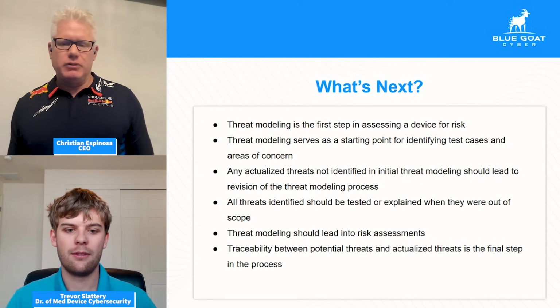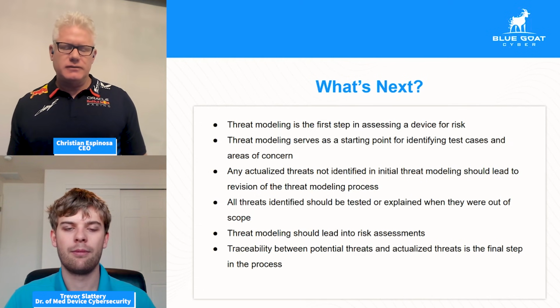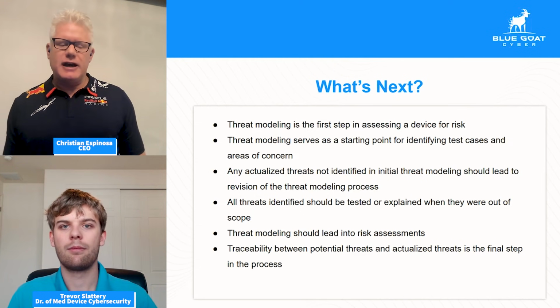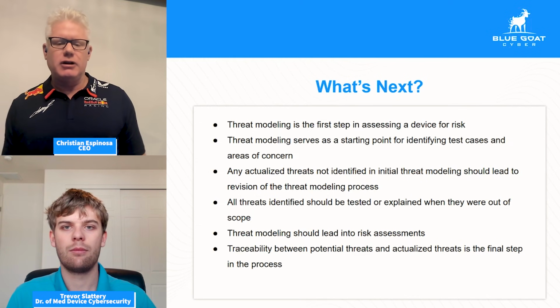I think you hit all the main points. I think the biggest one is moving it as far left as possible. So trying to design security into the system versus bolt on. That is the biggest challenge we see. Most manufacturers come to us at the last minute and they didn't do these exercises, and then it's more costly to try to add this stuff later, and it typically delays the clearance of the FDA or MDR.